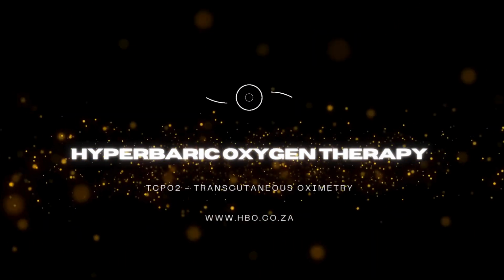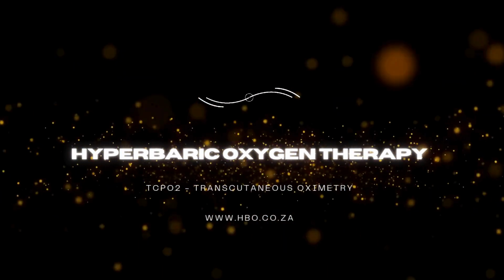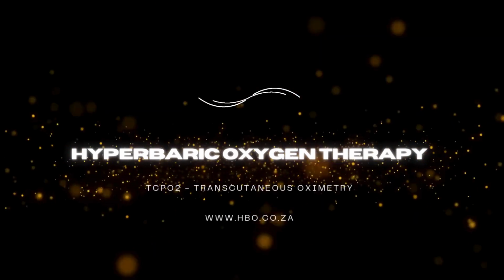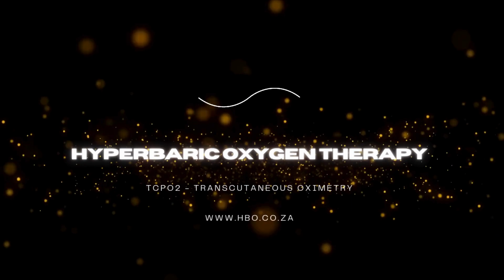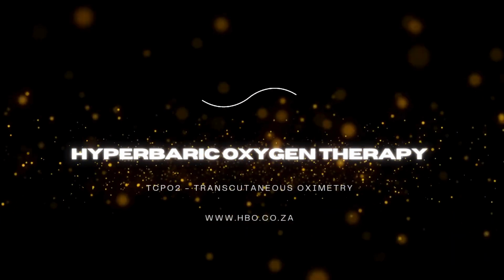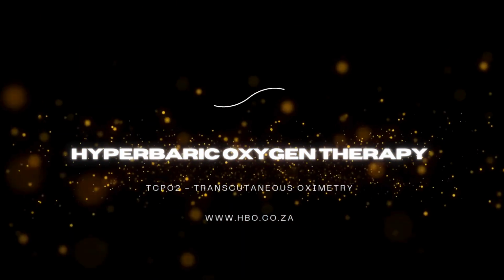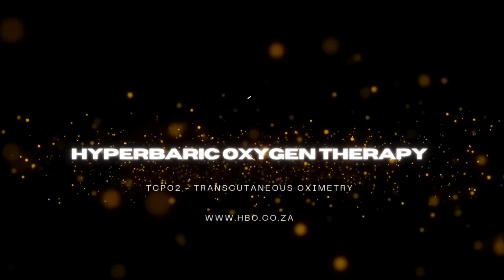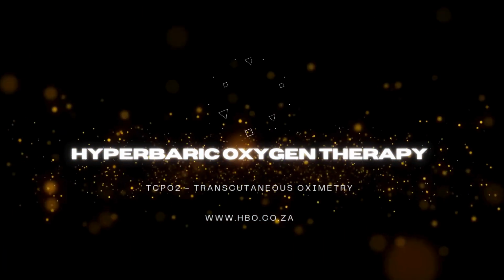The sources seem to back this up in a few areas. They do. Consider limb injuries where circulation is compromised. Research shows that doing TcPO2 measurements while the patient is breathing pure O2 at 2.5 atmospheres absolute, so under hyperbaric conditions, those readings can actually predict the final outcome pretty well in major vascular trauma. That's huge. It can really help decide if HBOT is even a worthwhile path to go down. So it's less about could HBOT help in general and more does the TcPO2 response suggest it's likely to make a meaningful difference here? Precisely.